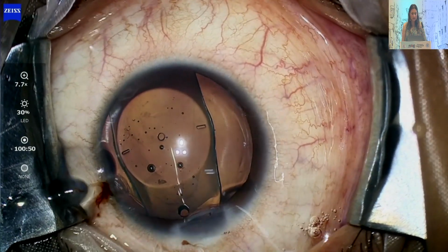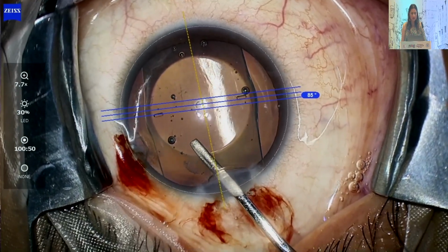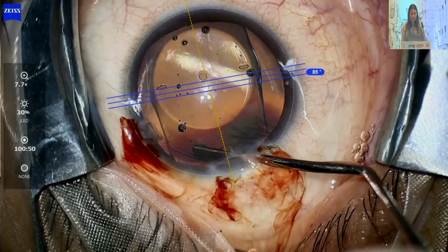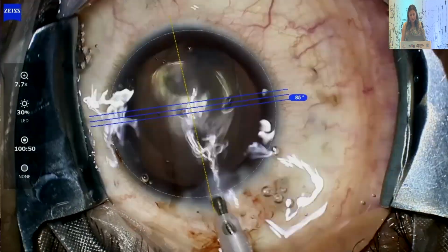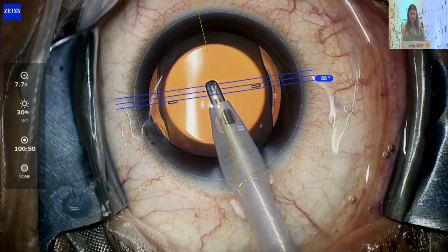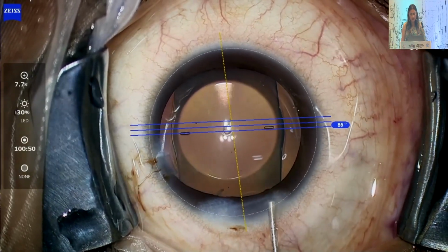And you must be careful to see the orientation of the lens. The leading hole must be on the left side. This is a toric implant, and I'm using a Callisto system to orient the lens in its correct axis. And this is the ICL manipulator invented by Dr. Sri Ganesh. The underside is sandblasted, so it helps in easy rotation and manipulation of the lens.